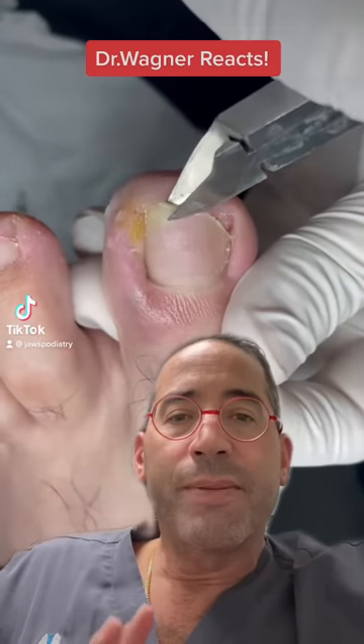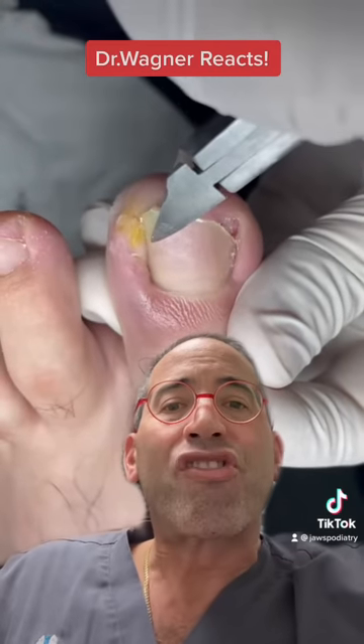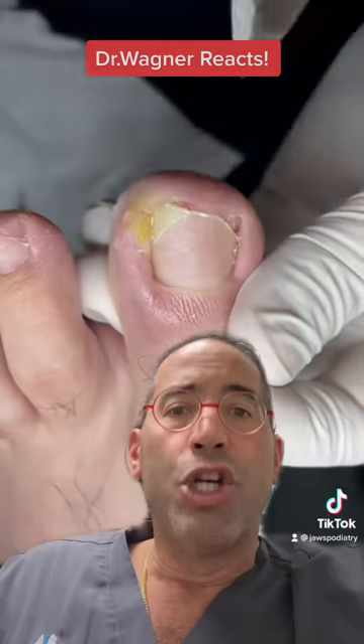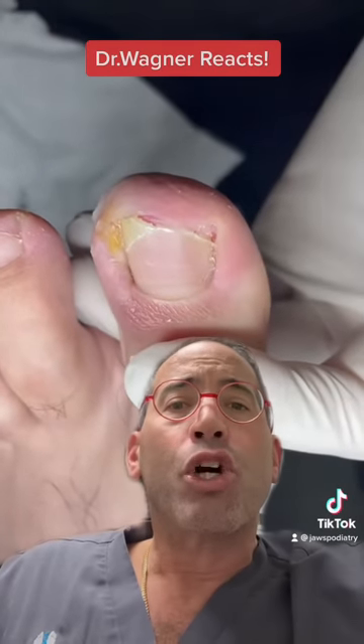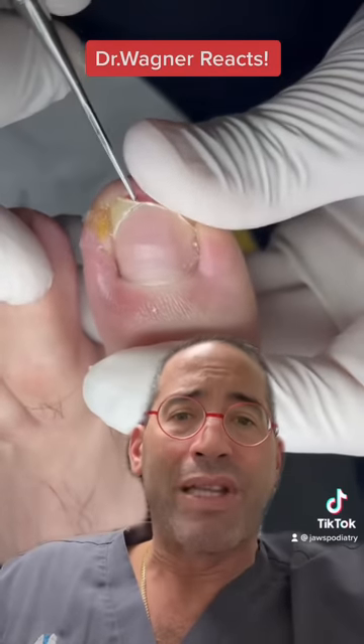Let's see what we got here. Here is severe incurvation of the nail plate. This is what we call a slant back. No anesthesia is needed. Aggressive trimming of the offending nail plate.